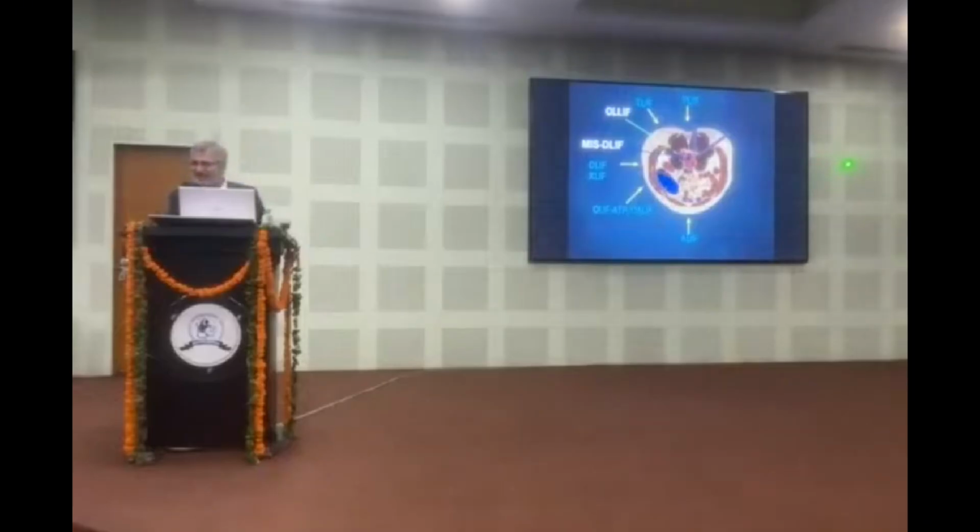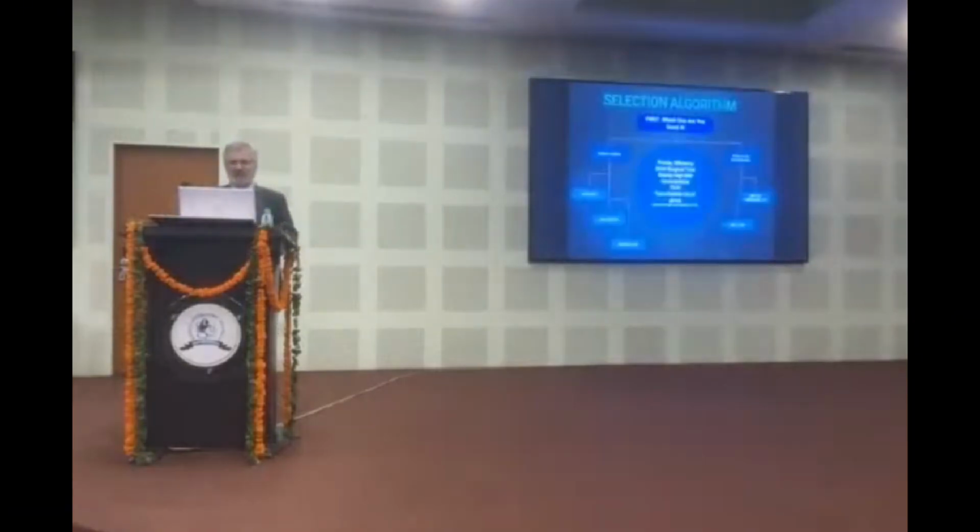Now, let's talk about how to get there. I'm not going to talk about the selection algorithm, but practically, this is a very efficient surgery. But if your primary goal is to cut the bone and open up the space, this is not the right thing. The primary goal for some surgeries, in some situations, is to change the anatomy of the bending of the spine.